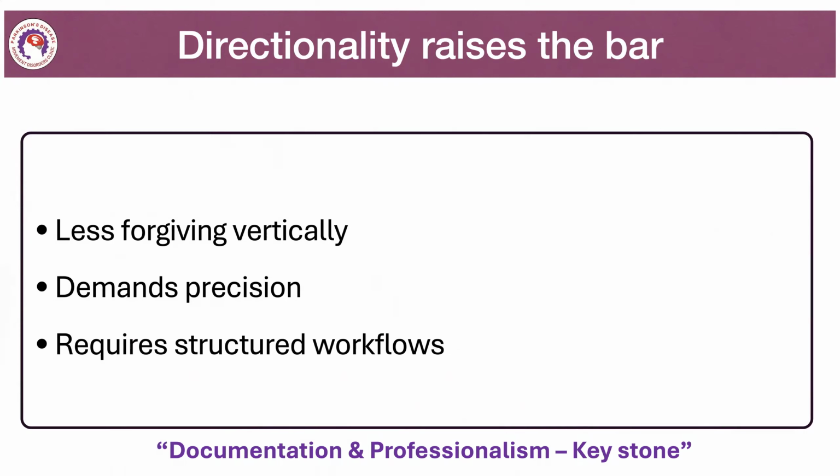But any patient who is going to go from step 1 to step 2, step 3 of programming, if you had not documented the first assessments, and subsequently whenever changes are made, what changes and why, it becomes a pain. Always remember that for all DBS, it's a long-term goal, not a short-term goal.